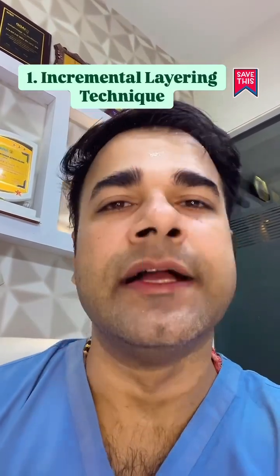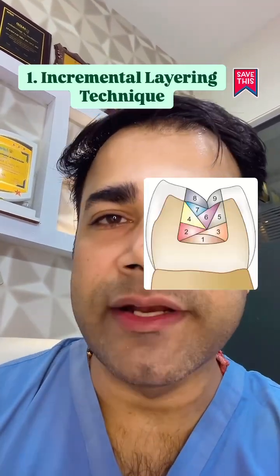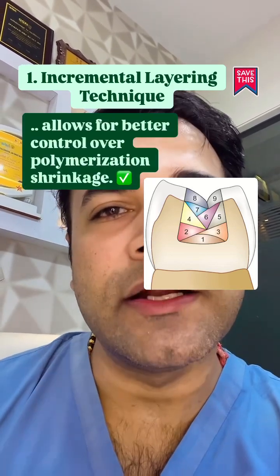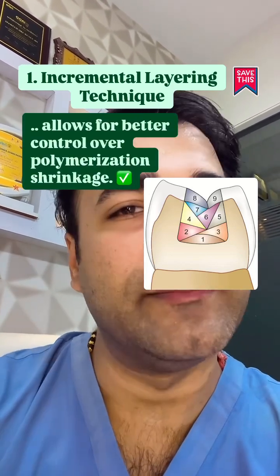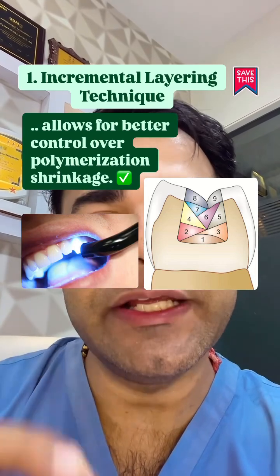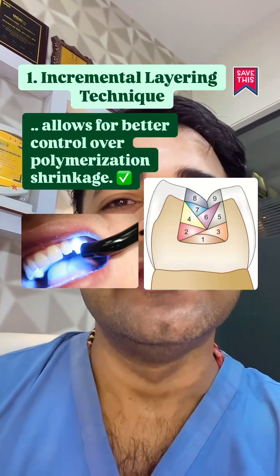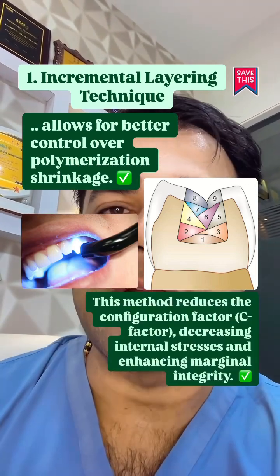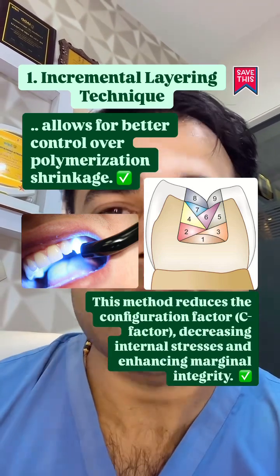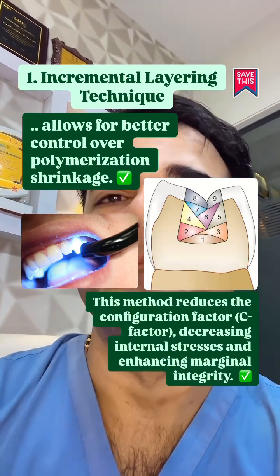Incremental layering technique: applying composite resins in small increments of about 2 mm thickness allows for better control over polymerization shrinkage. Each layer should be individually cured before adding the next. This method reduces the C factor, decreasing internal stresses and enhancing marginal integrity.